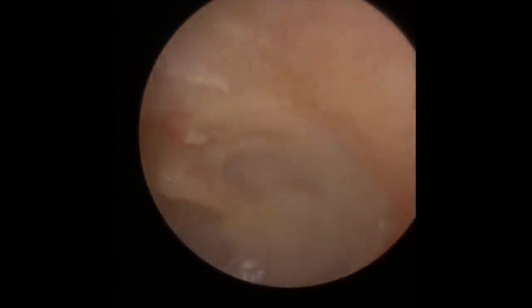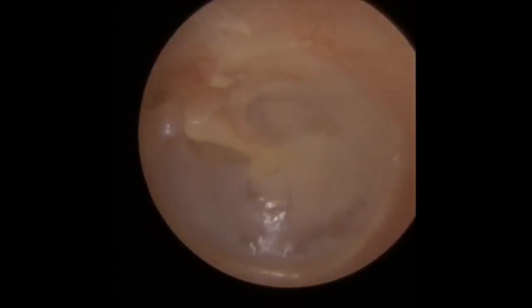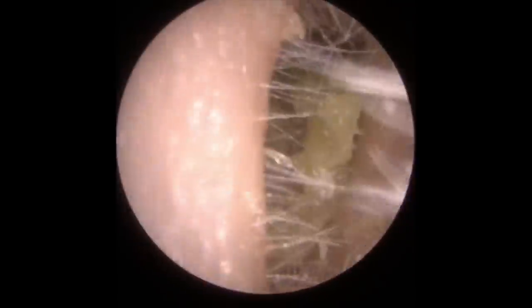Last little flake there at the base of the canal — there we go. Take a good look at that eardrum. The eardrum is a little bit on the dull side, not such a good light reflex in there.